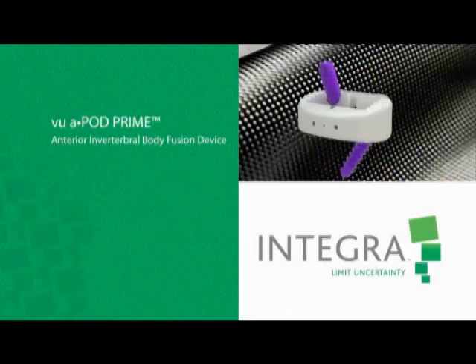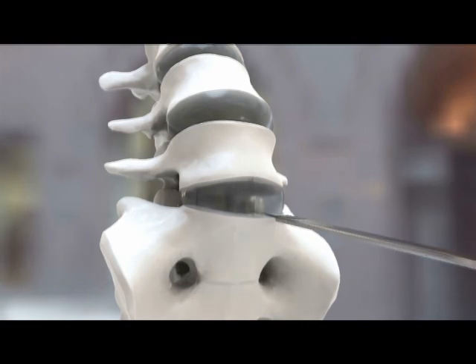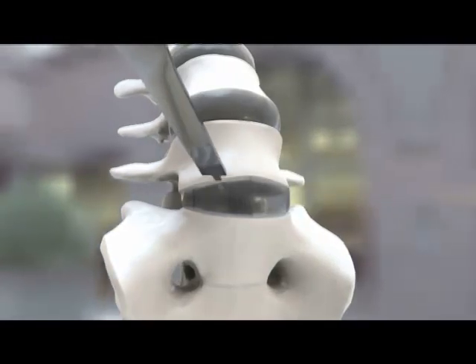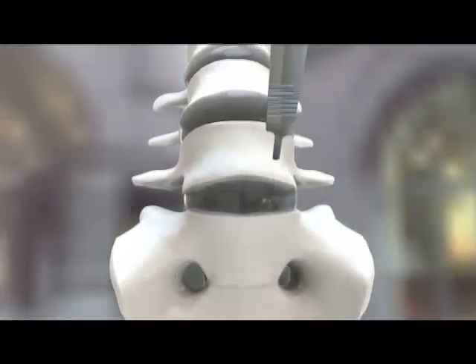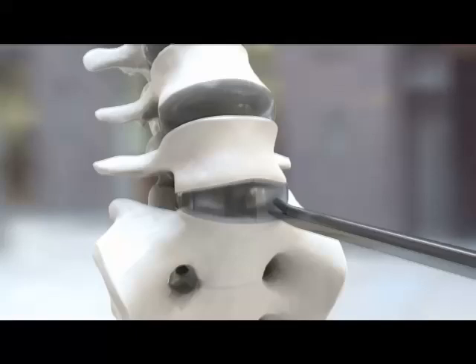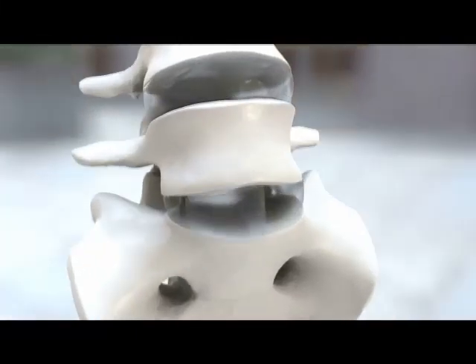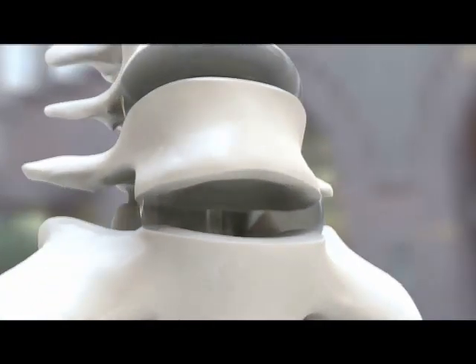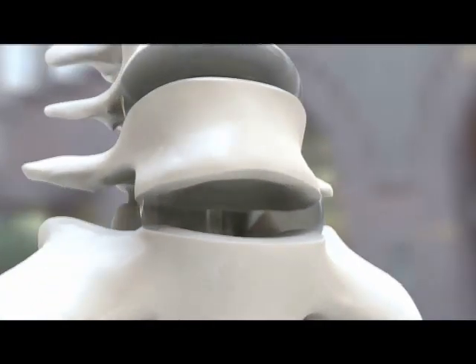Now let's take a closer look at the anterior lumbar interbody fusion procedure. The procedure is performed in conjunction with a vascular surgeon. Once the disc space is exposed, a knife or another device to cut the disc is used. Following this, we remove the disc using various tools, such as a curette, as you see here, as well as something to roughen up the bone so that it allows for bleeding and placement of the device.